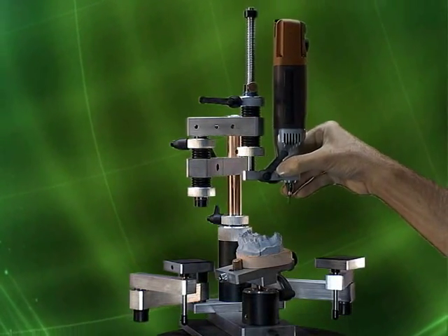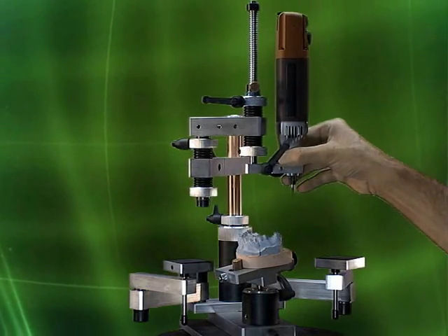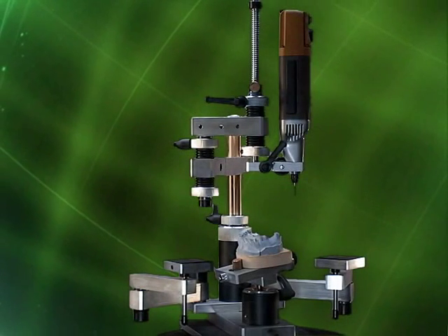With our MX series, you can mill in all three axes simultaneously. We call this milling on the fly.